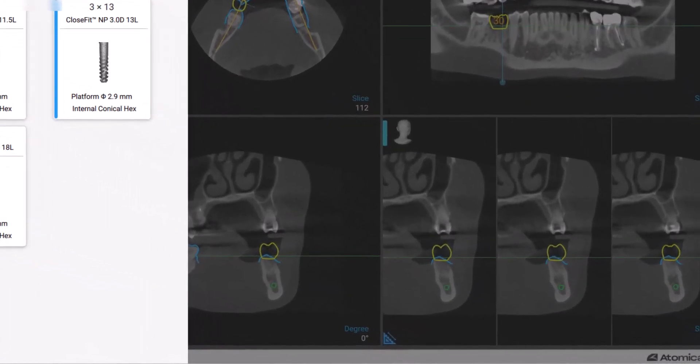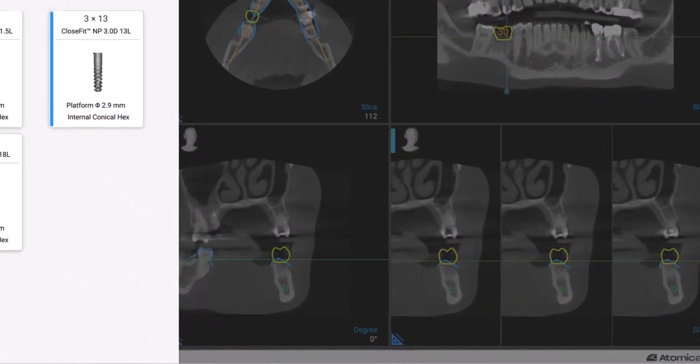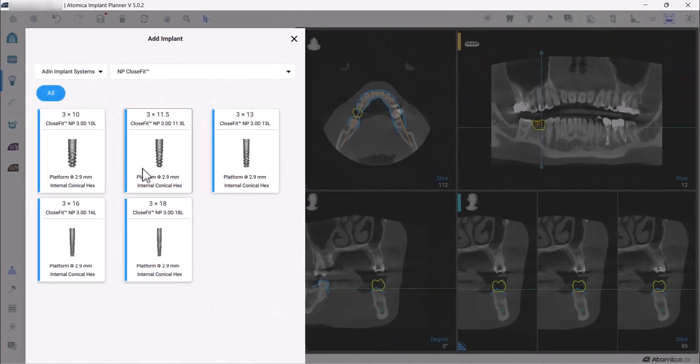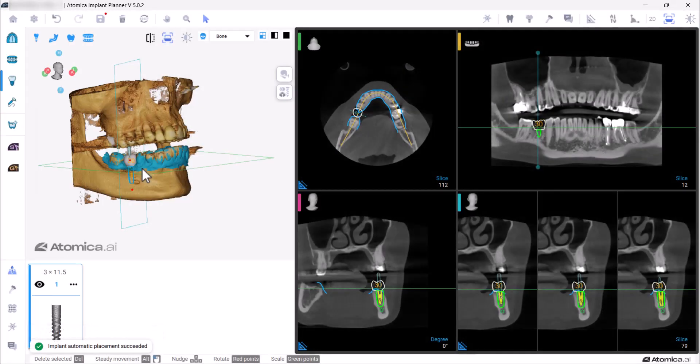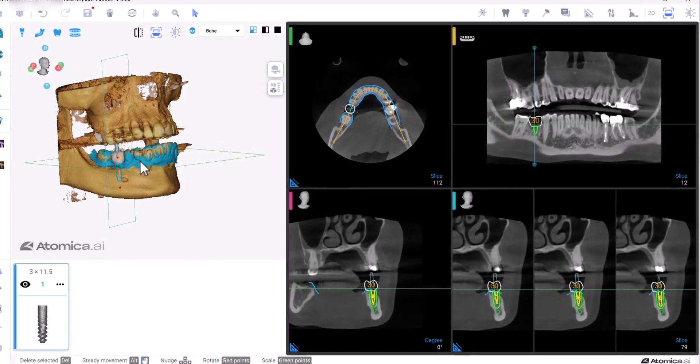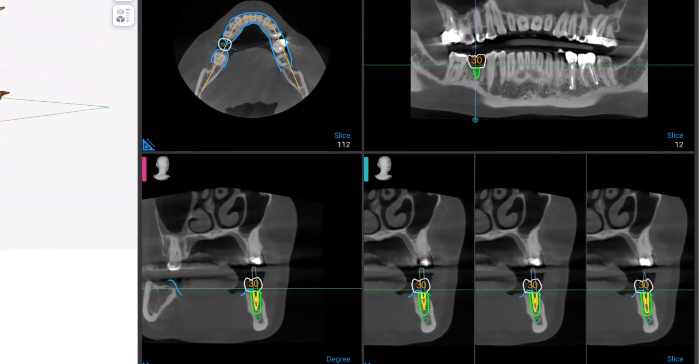As you can see, a virtual tooth is placed automatically in its position. Then choose the implant you will use, and with one click the implant is automatically positioned.